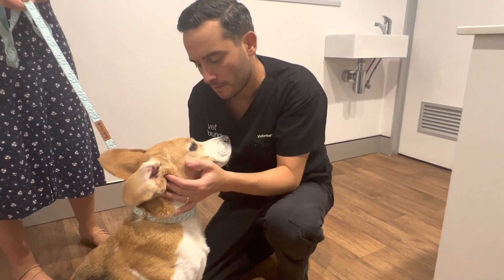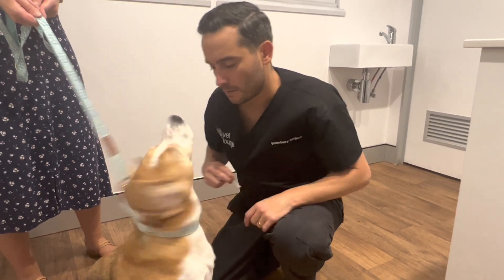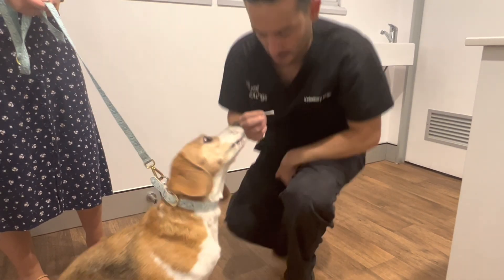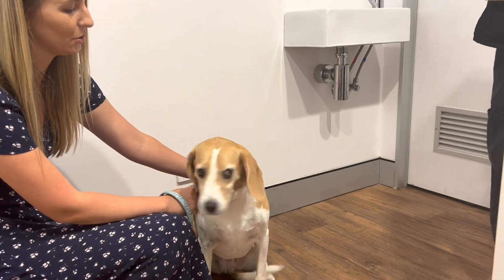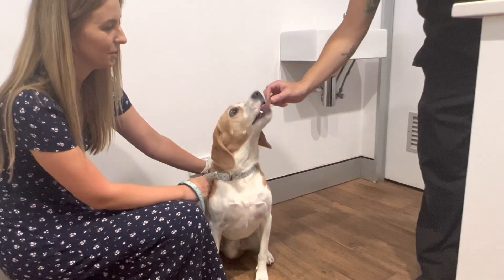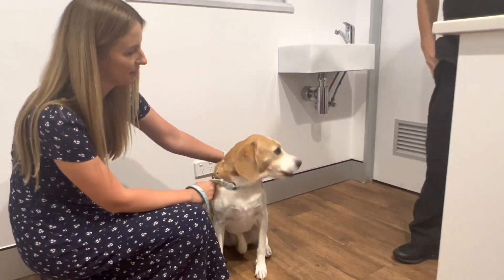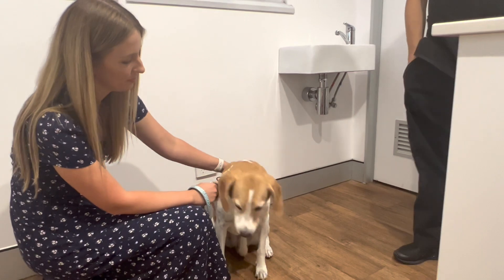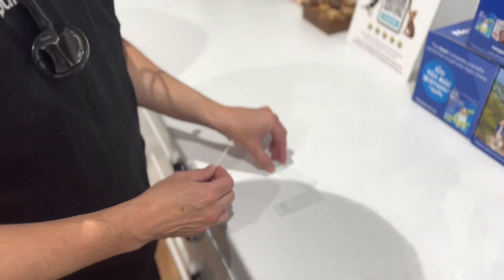If the patient's ear is too painful for collection, sedation may be required to make them more comfortable. We want the sample collection to be as pain free as possible for your pet.